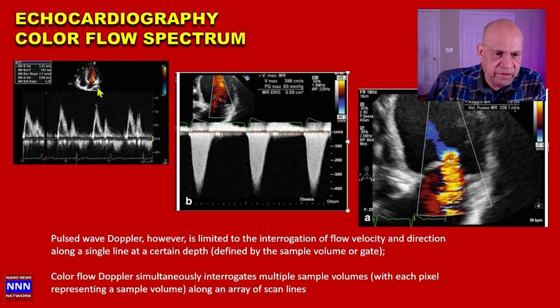The difference between a pulse Doppler and a continuous wave Doppler is that a pulse Doppler just looks at one point of reference. What is happening exactly at the tip of the mitral valves? In this example, you can see my green arrow here, and what's happening at this tip, and it ignores all the other velocities in the region. Whereas a continuous wave, which has a circle here and dots along that, is showing all the velocity changes along the course of the Doppler wave. And that's why we see this beautiful smooth pattern suggesting mitral regurgitation.